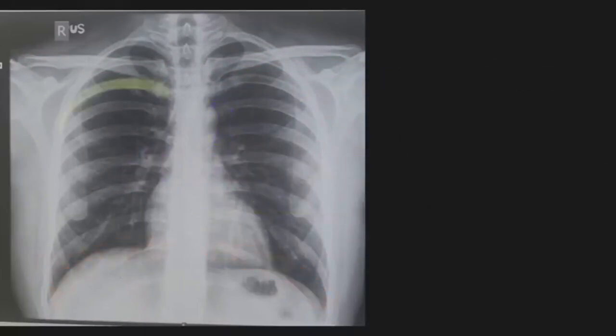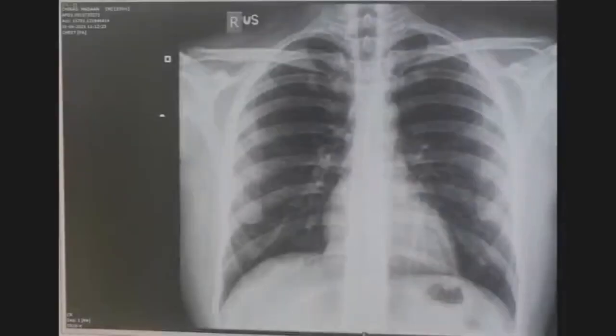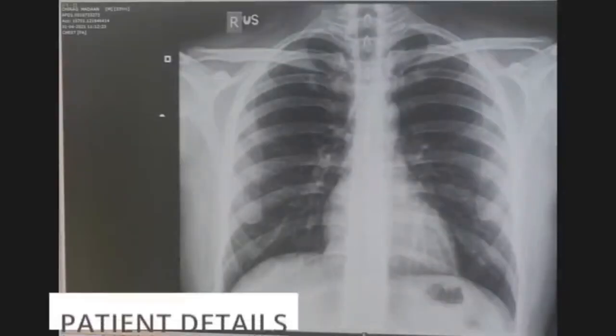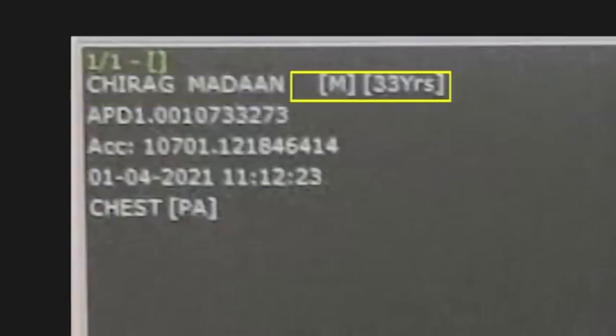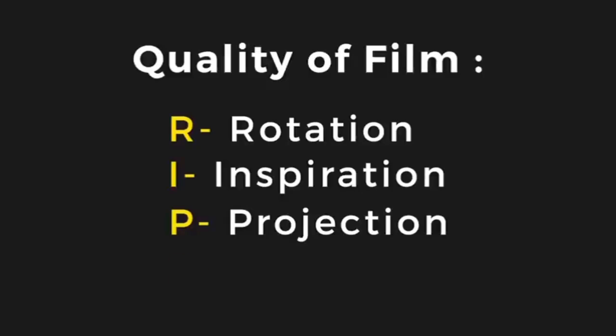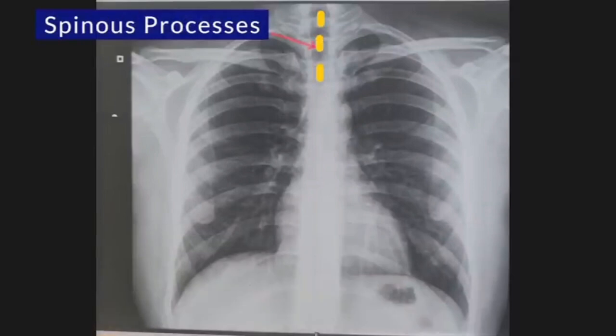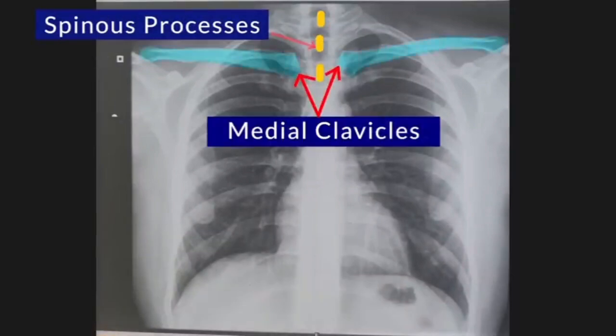So we're unpacking a lecture by Dr. Chirag Madan from Intellect Medicos today. And his entire goal is to stop you from just seeing shadows and start seeing the actual story. Right. And we actually want to give you the whole topic in about 1 minute, like a rapid fire cheat sheet. Challenge accepted. Basically, you need two mental frameworks to avoid misdiagnosing a patient.